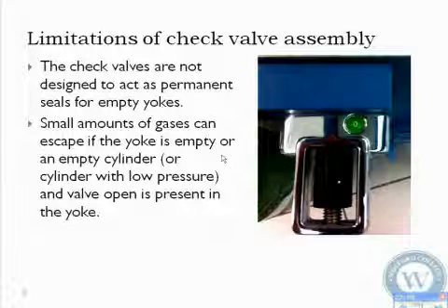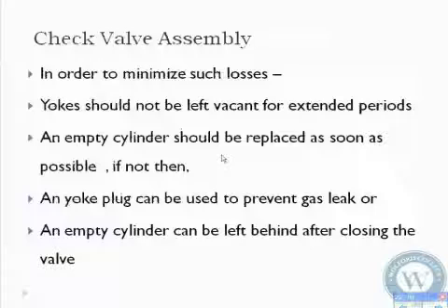I guarantee you're going to see many machines that don't have them placed, but they should be. If they're not, then small amounts of air can consistently leak out, and you can lose your cylinder pressure over time. Or with nitrous, it can leak out and pollute the OR. So we're supposed to put those on, so make sure that you keep those on. Them not being on is not an excuse for you not putting them on. They're there to prevent loss.